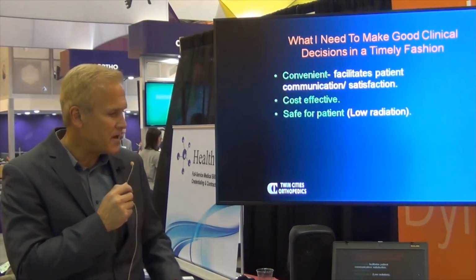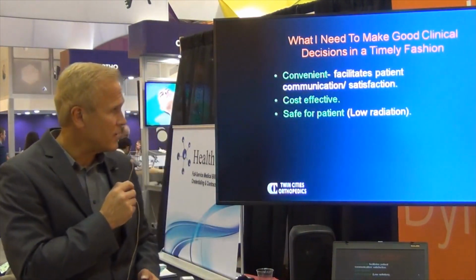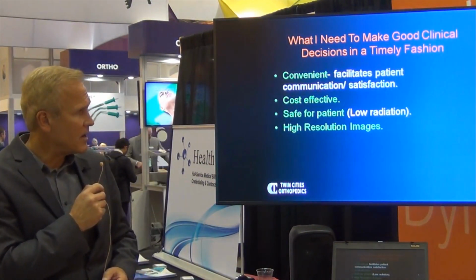So it's got to be safe for the patient. Again, traditional CT scanners are usually quite large machines with a lot of radiation, and that's one of the reasons why we don't get a lot of CT scans: the vital organs are exposed to a fair amount of radiation. And they need to be high resolution images.